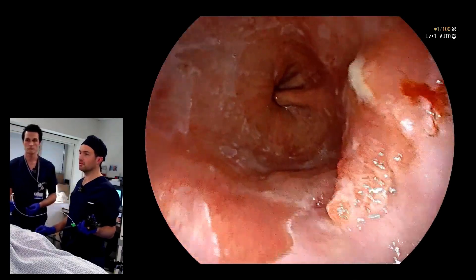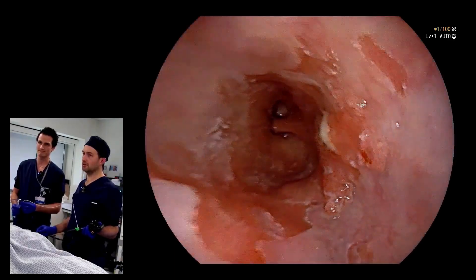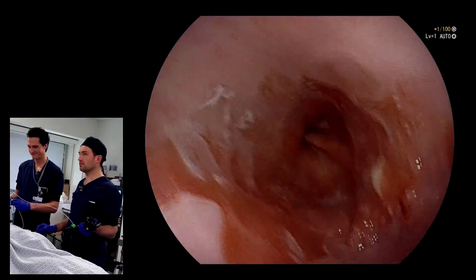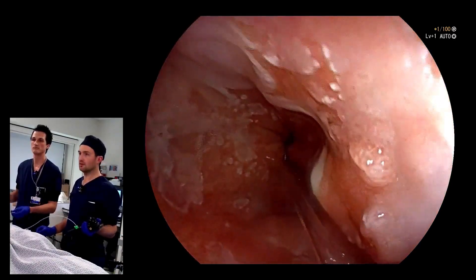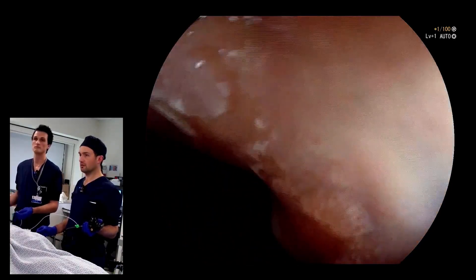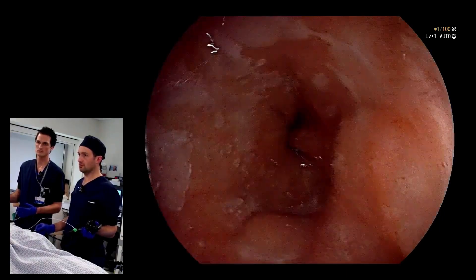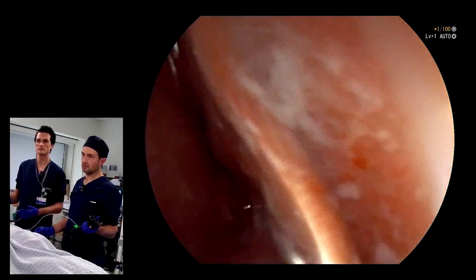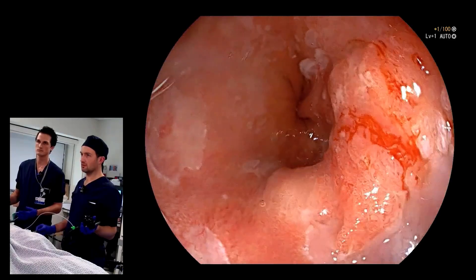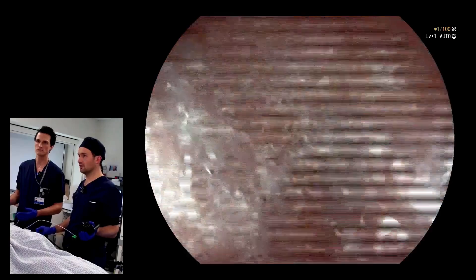Let's stick on this. If we wash this off, we need a bit more power, I think. The water jet's now looking a little bit limp. Can we increase the water jet, please? You want the water jet not to be so powerful that it destroys the imaging, but usually you can wash off this surface fibrin and then — there we go. You see? And so, under this — as you can see, it's come off. Now, if we put the whole thing a little bit under... the patient's intubated, so we don't have issues. We don't have zoom on this scope, but I think that's still fine. You see that that was bleeding, was on an area, but it's not ulceration — it is simply fibrin on the surface of a certainly dysplastic, high grade, or maybe even cancerous lesion.